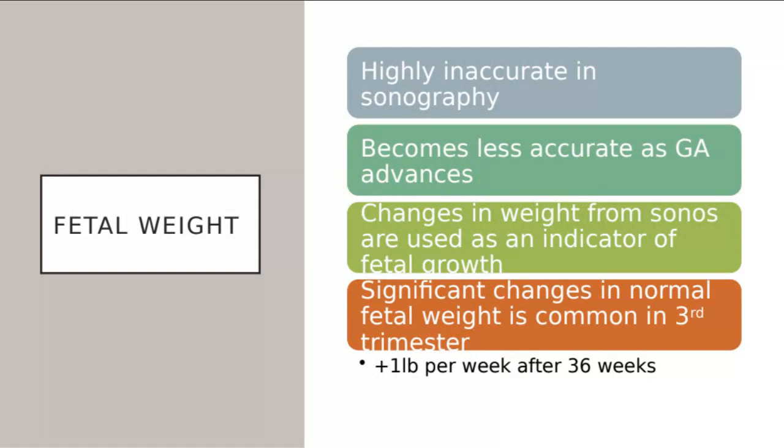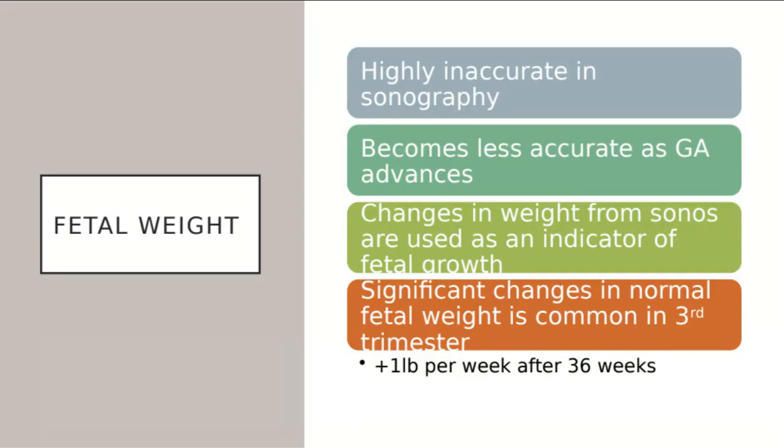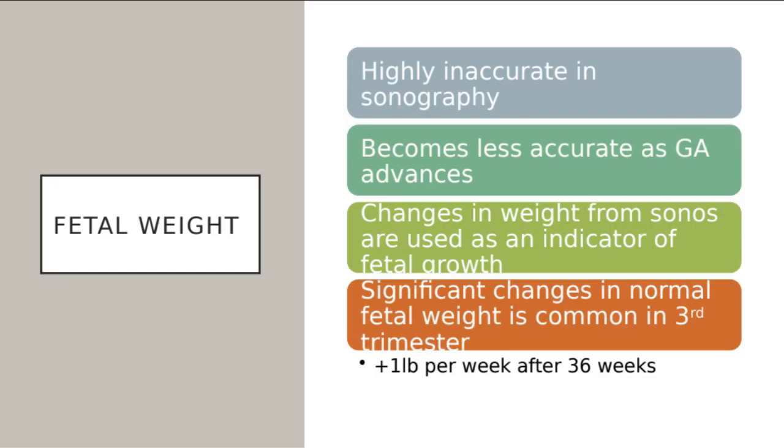For some reason, a lot of OB physicians rely on ultrasound for fetal weight, and they tell their patient what that estimated fetal weight is based off of their ultrasound measurements, and then they push the patient to get C-sections. Because they are saying, oh, on your ultrasound, the estimated fetal weight, your baby is already 9 pounds and you still have 4 weeks to go. When it's so highly inaccurate.